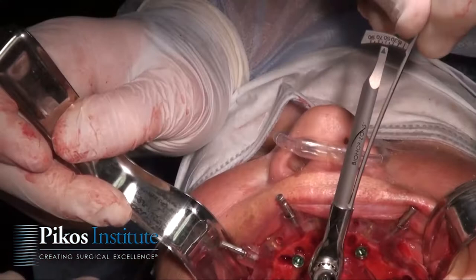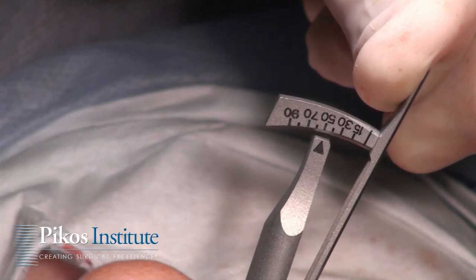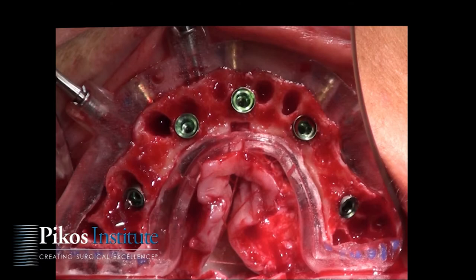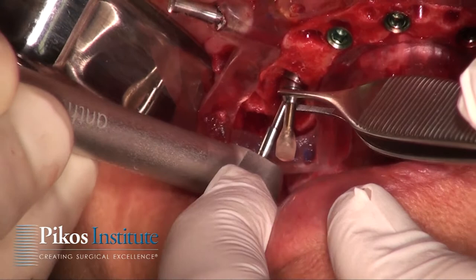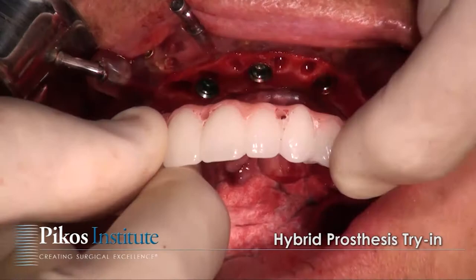The mounts are removed and the surgical guide is removed. We verify the torque of the implants, which are at least 35 newton-centimeters or greater. Bone reduction is done as we would typically do with our conversion cases. Multi-abutments are all selected in advance in terms of specific type including cuff height. The handles have already been shortened to allow for a very seamless workflow with this protocol.